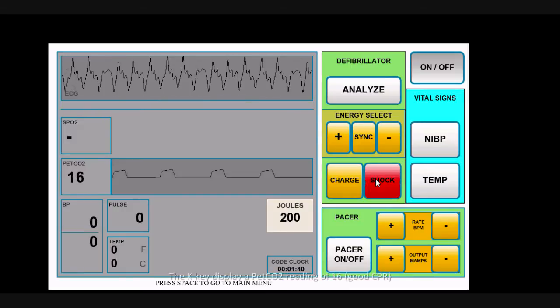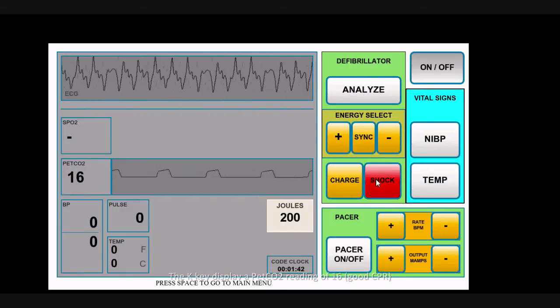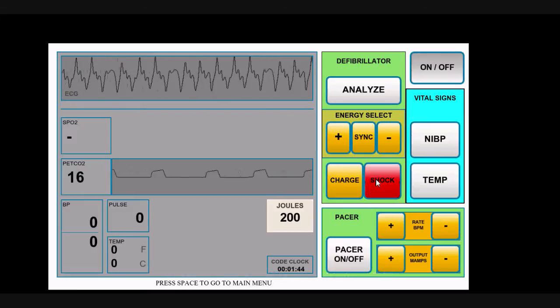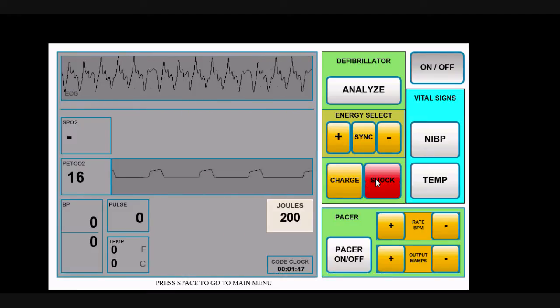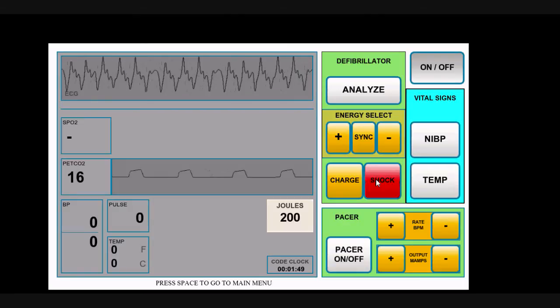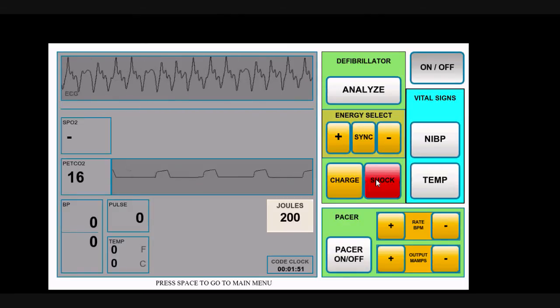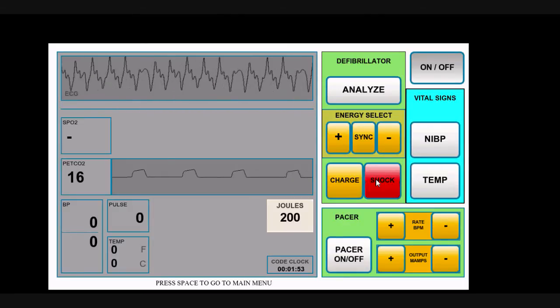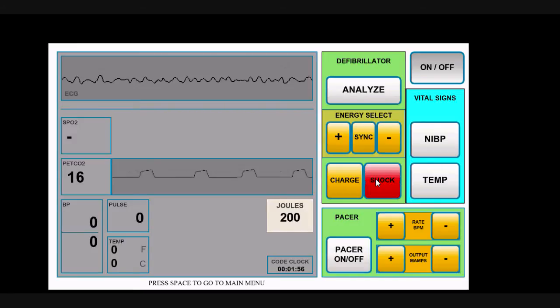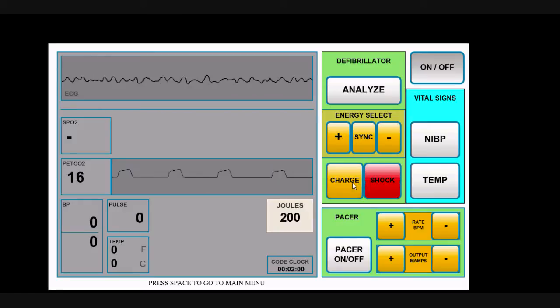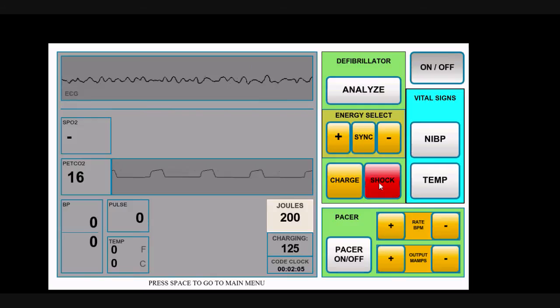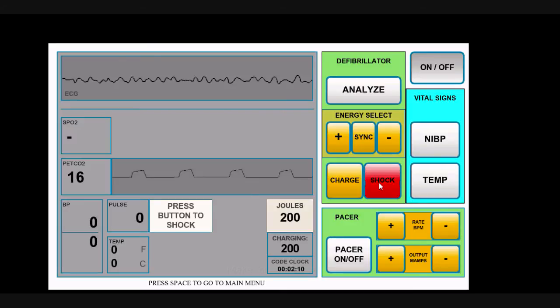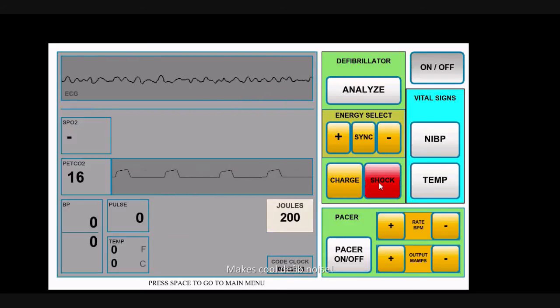Let's say your two minutes of CPR are up. They've stopped CPR. You decide to give them their rhythm back, which is still V-fib in our case. We're going to go ahead and charge. When you hit your 200 joules, students can clear the patient, press the shock button, and then CPR can be resumed again.